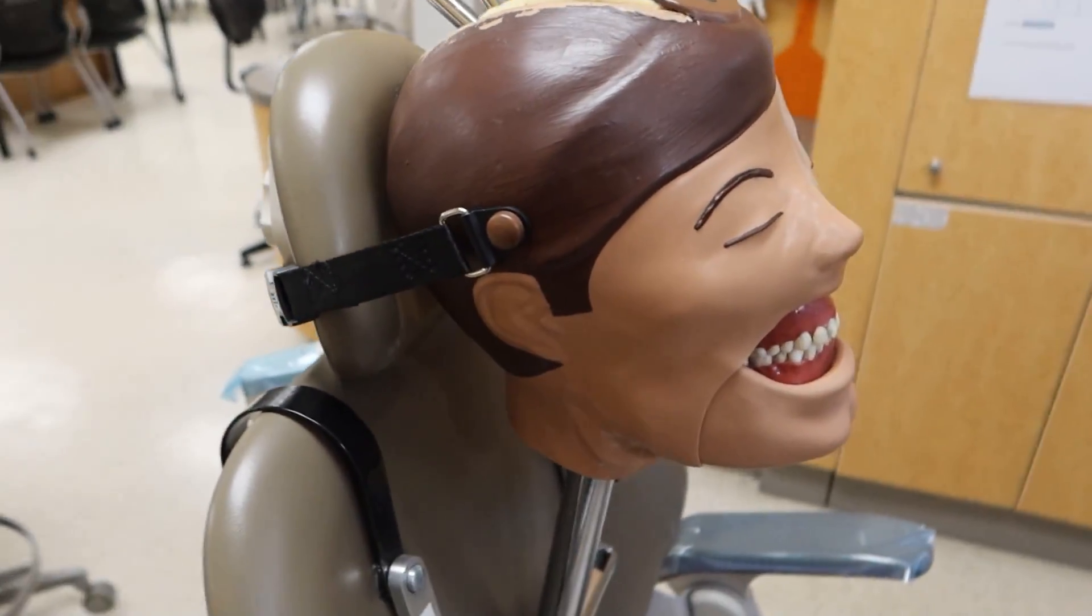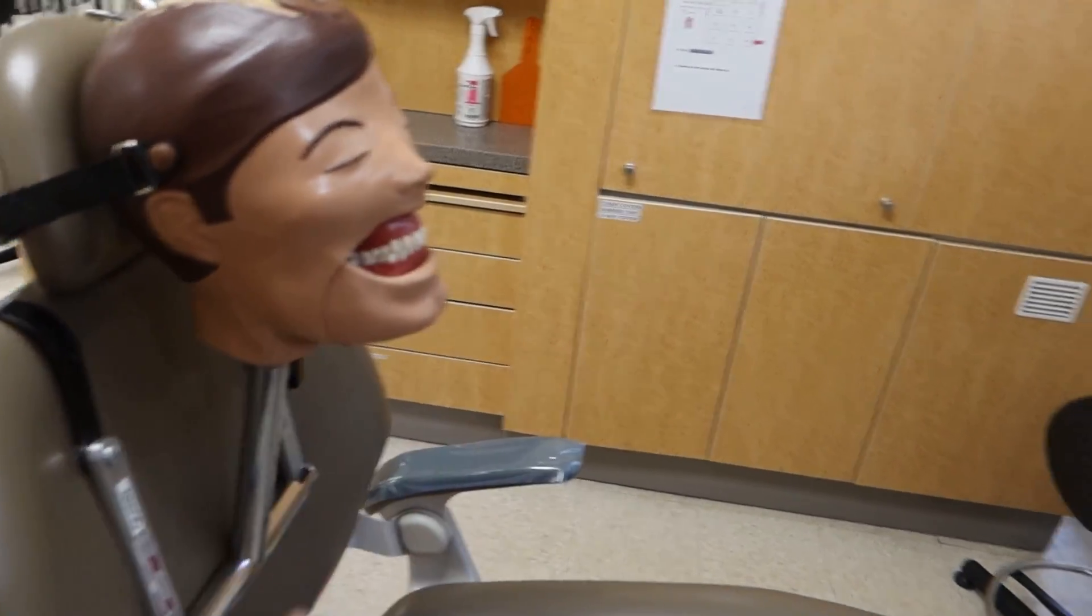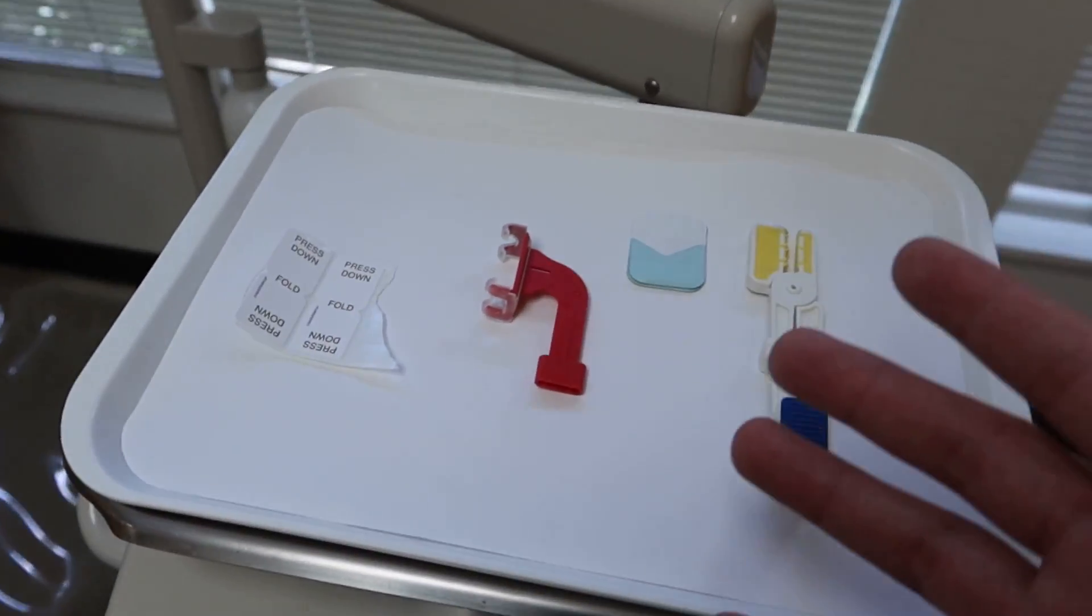Oh hey Quinn, what are you doing back here? Well, I guess it's your six month appointment, so let's go ahead and get some x-rays on you, but let's go and talk about those x-rays that we're gonna be taking today.